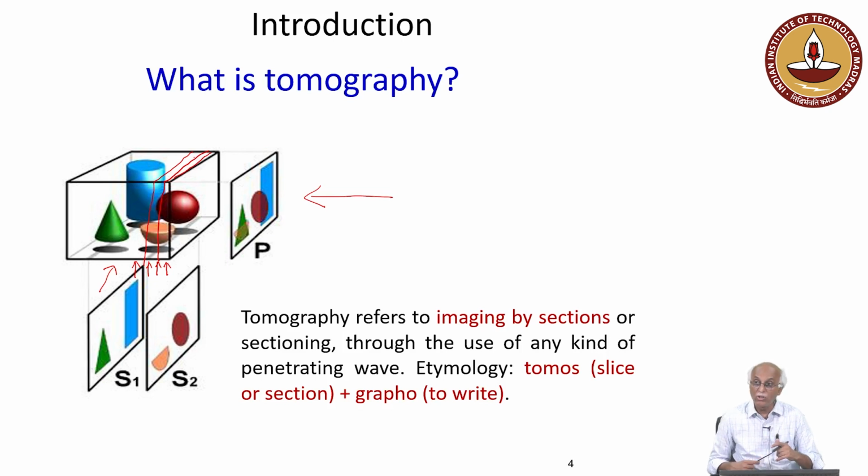But if we are using an optical approach, the optical frequencies we consider in biophotonics are limited to slightly into the UV range, up to maybe 355 nanometer or so, and then longer wavelengths: the visible range, 400 nanometer to 700 nanometer, and then the infrared range, near infrared, up to maybe 2.5 micrometer or so.